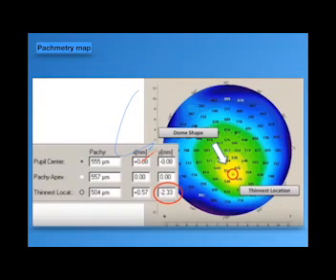If you found a patient with an inferior pachymetry map showing a point of 500, and at the same point superior it's 540 at the same circle, it could be suspicious, because the accepted difference between the superior and the inferior points in the pachymetry map is within 30 to 35 micrometer.